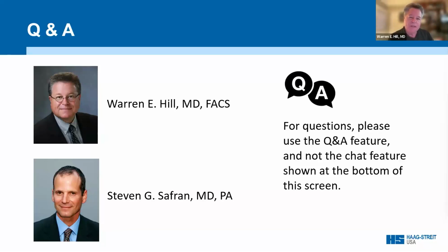And the nice thing is you have 24 images to look at. You've got 6 sets of 4, and you can just click through them all. And if one set of the 6 doesn't look right, uncheck it and then go on to the next. And usually you'll have 4 or 5 sets of images that are correct, and you're on a solid footing and you're good to go. So at least you have that luxury of being able to pick and choose which images your Ks are going to be based on.